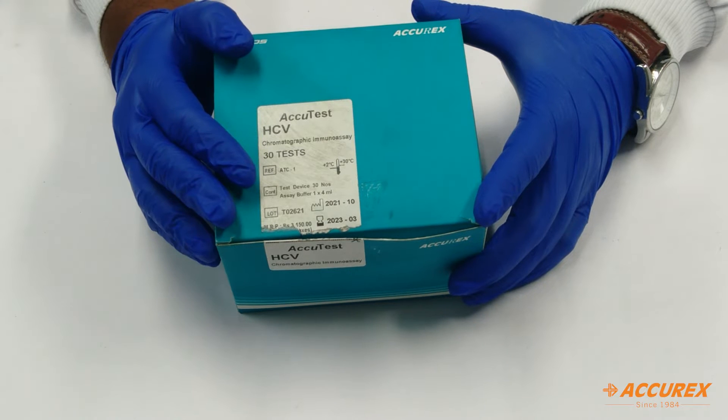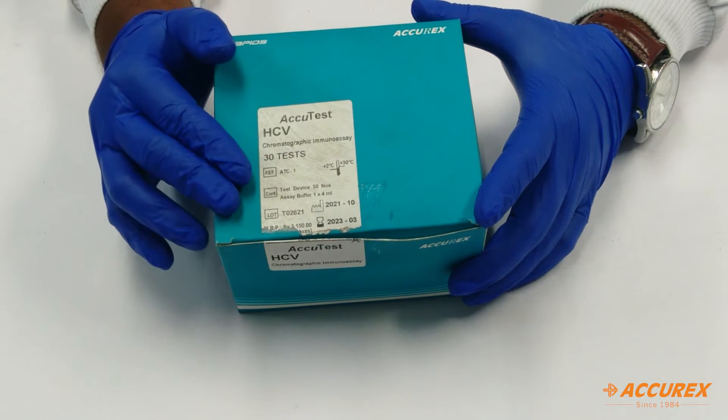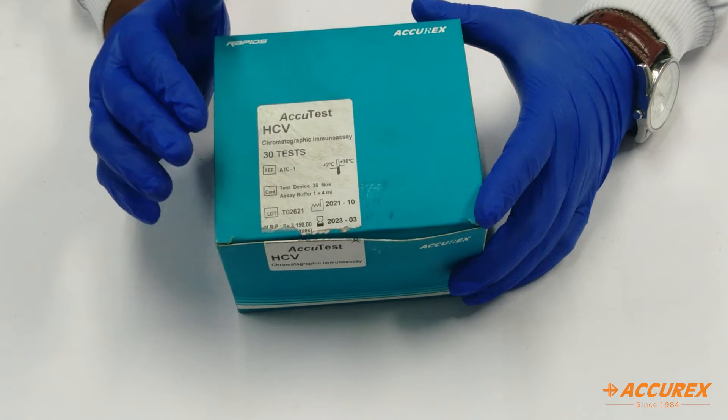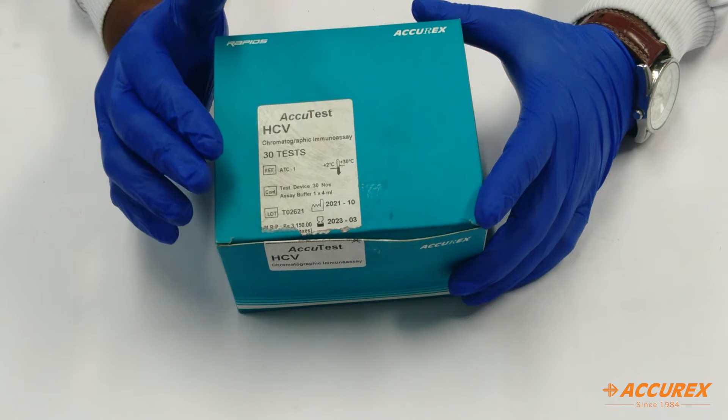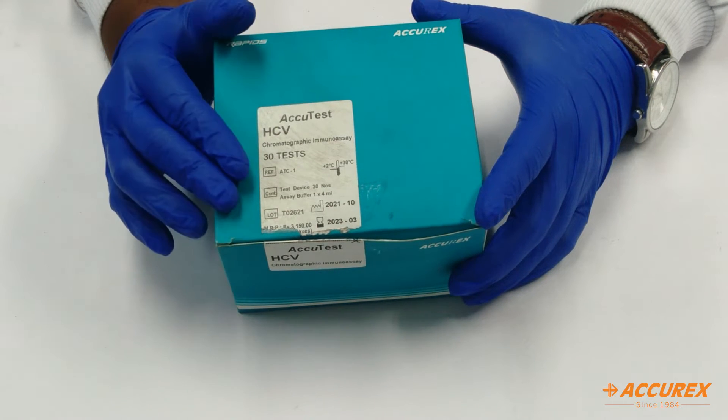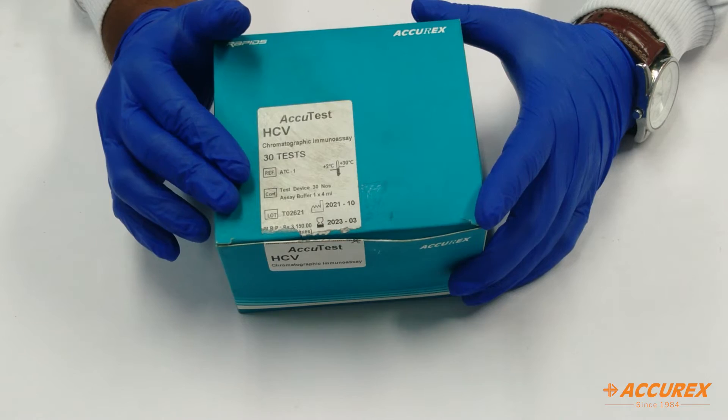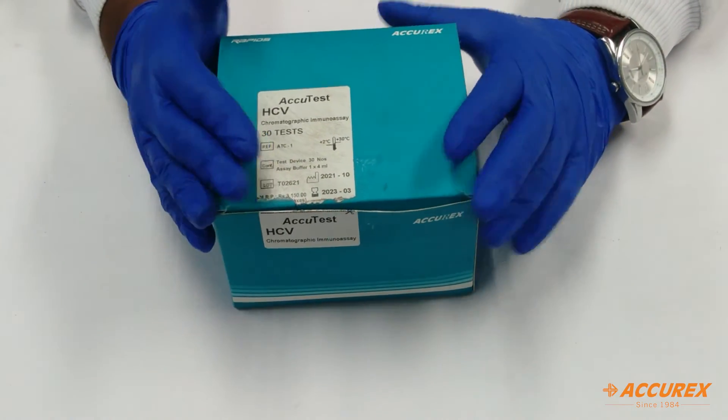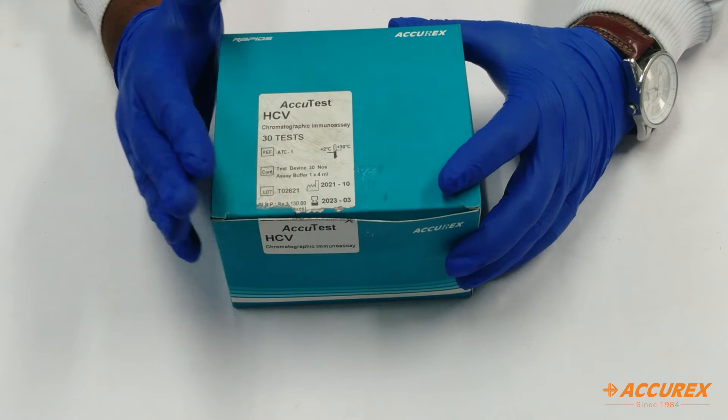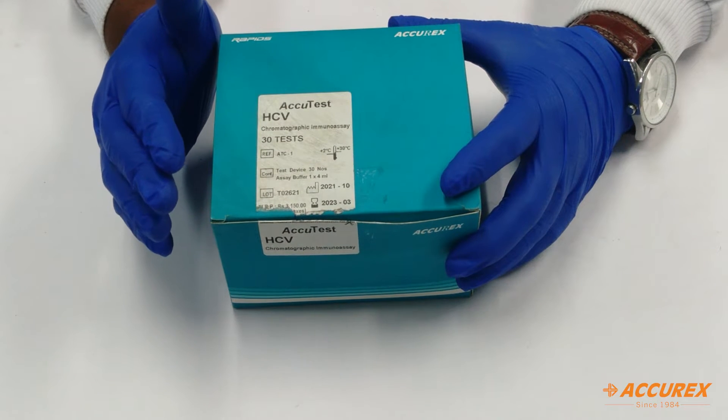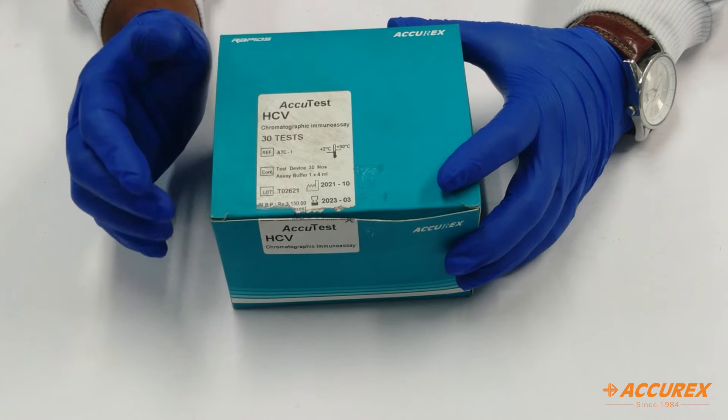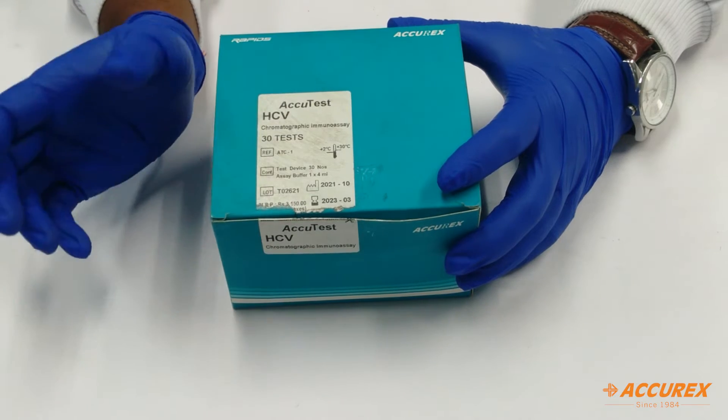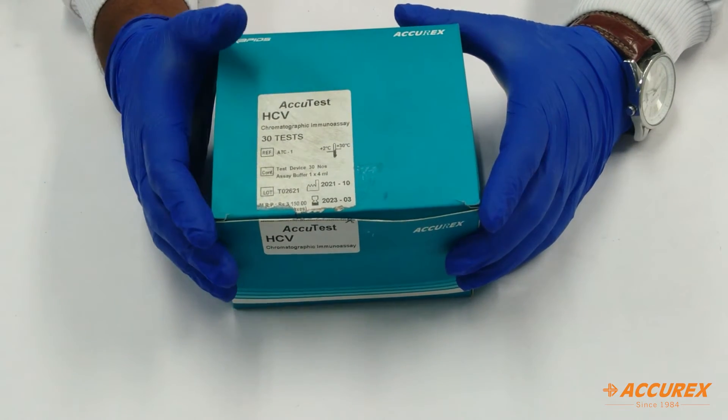What comes inside the box? Before that, we'll see what precautions need to be taken and how to handle the product before testing. How to handle the product is simple: store the kit at 4 to 30 degrees Celsius. When you are going for testing, bring the card to room temperature. For the sample, you need to handle it with gloves since it is infectious.